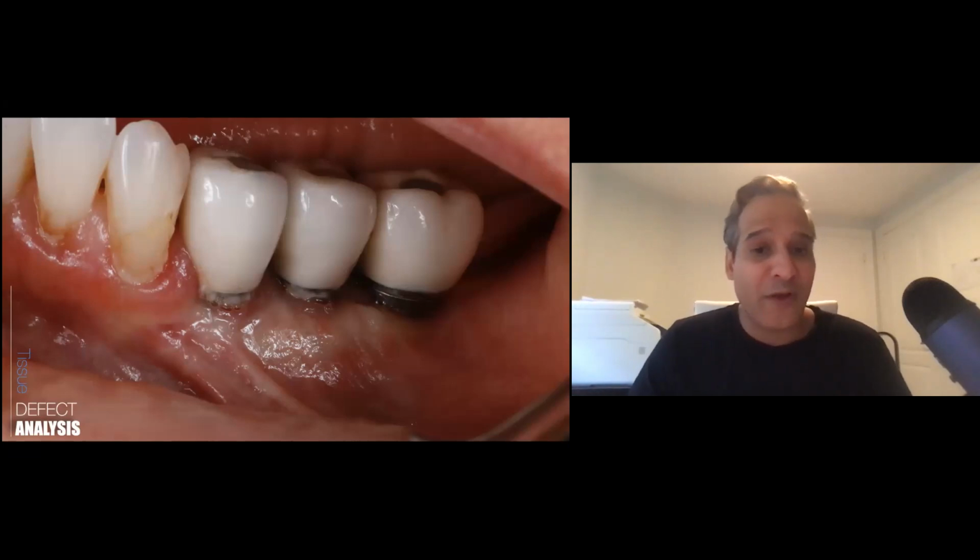Now, onlay grafts like this can be used mainly as well for implants, because remember, if you have a thicker, wider band of attached keratinized tissue, it's going to make plaque control easier. It's going to make sure that you have less effects of inflammation on the site, and overall make it easier to maintain and stay healthy.